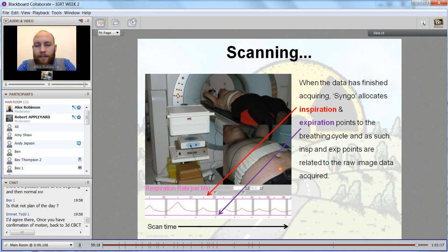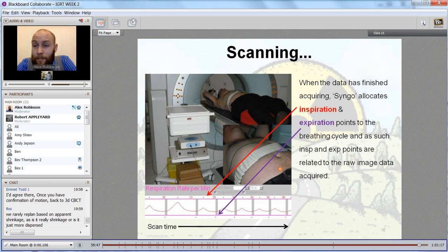It all depends on where this tumour is, and you would definitely have to have conversations with the dosimetrists and physicists to see what impact that would have on the actual plan. Without a doubt, they'd have to look at that. And then there are these systems that are able to plan from the CBCT. So yeah, I wouldn't like to say 100% one way or the other on that one, I'm afraid.